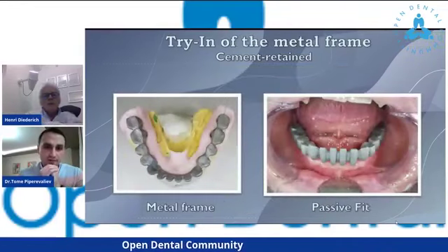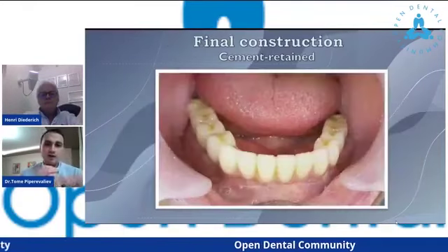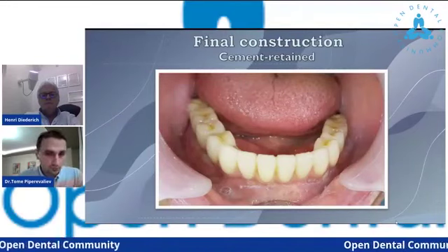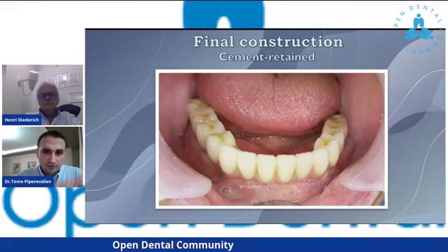And this is the metal frame on the final cast and in the patient's mouth. And here we can see the cement-retained metal ceramic bridge over 6 implants loaded after 4 months.